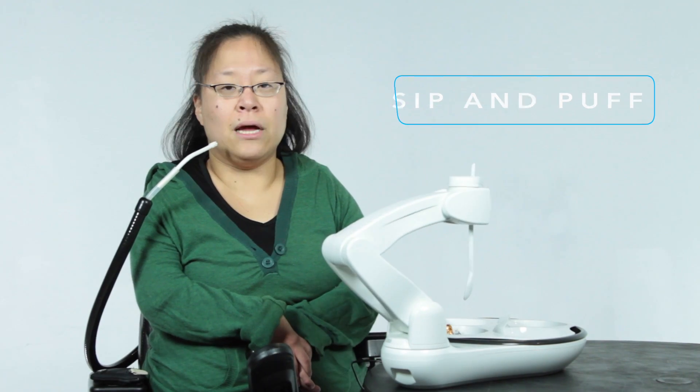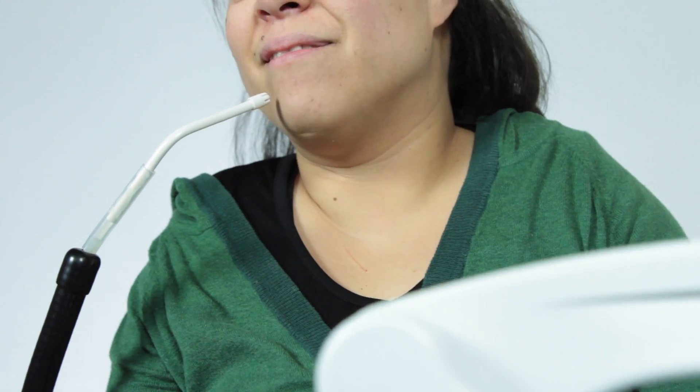The last way I'll show you how to use Obi is with a sip and puff attachment. This is helpful for people that don't have any range of motion from the neck down.